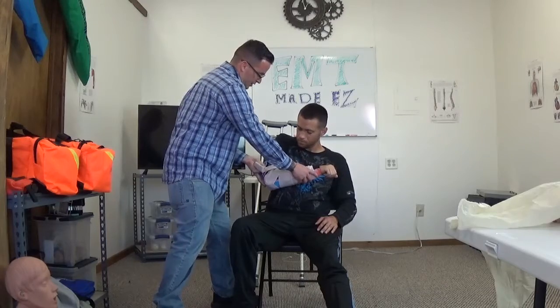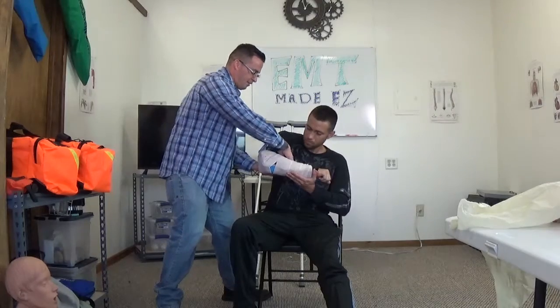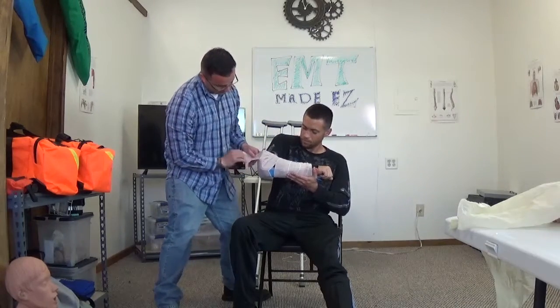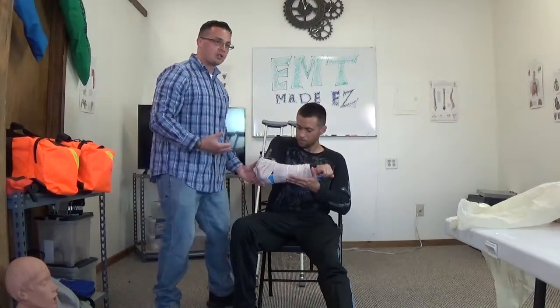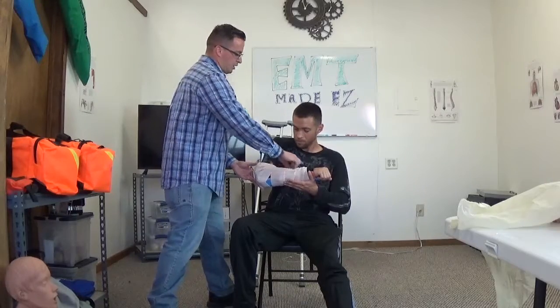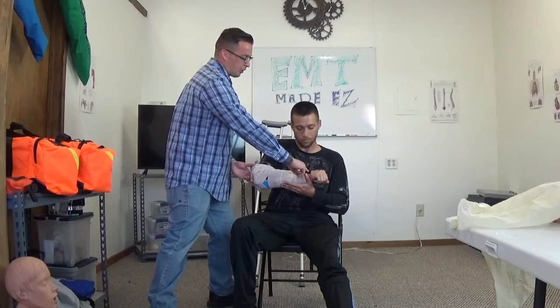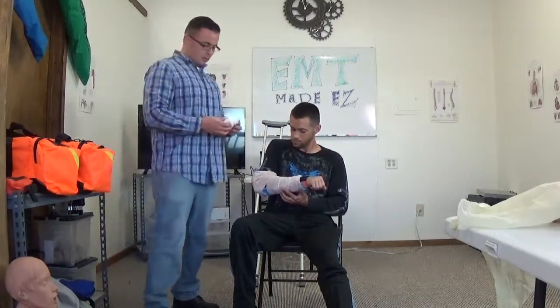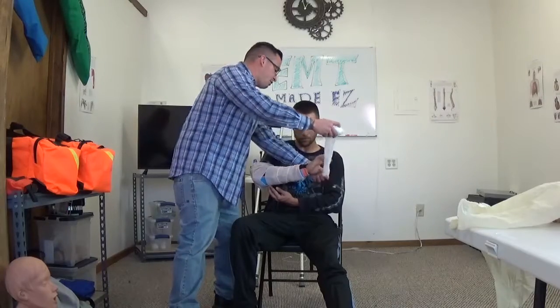This should be good enough for now. If needed, I would personally put one more bandage over this just to make sure I go past this joint right here — I'll go ahead and do that just to be safe. There is no such thing as overdoing it when it comes to this skill.